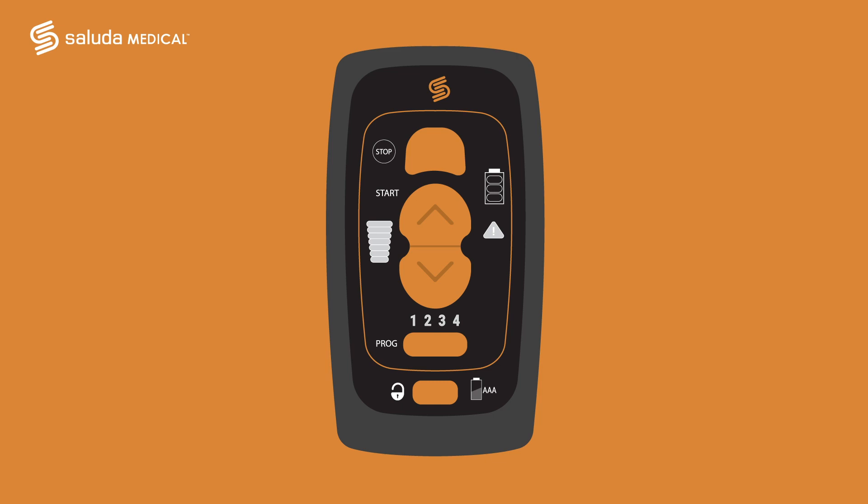When your device was set up, you may have been given more than one program to use. In order to change from one program to the next, press the change program button in the lower middle of the remote. Press it again to scroll through your available programs. When a new program has been selected, stimulation will be turned off.